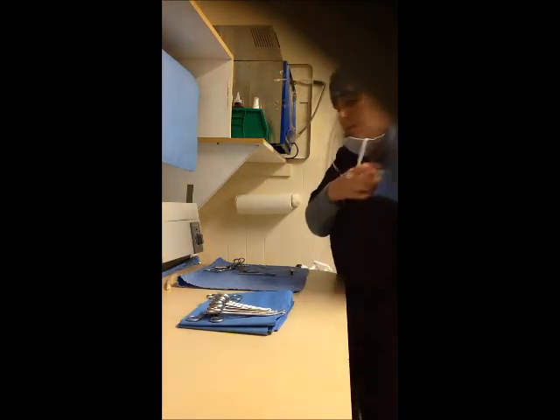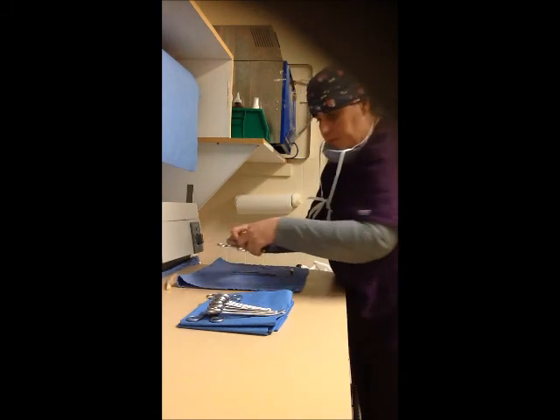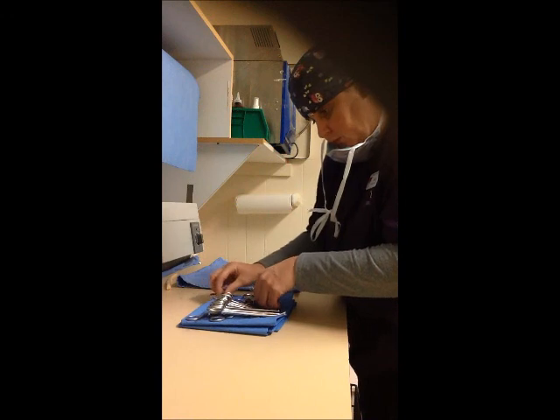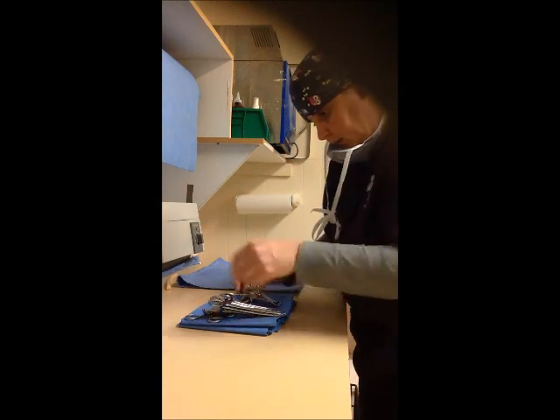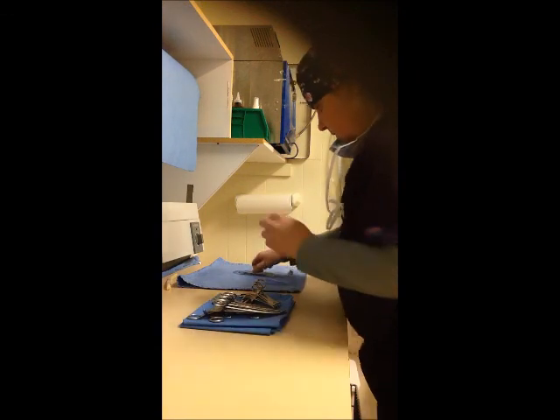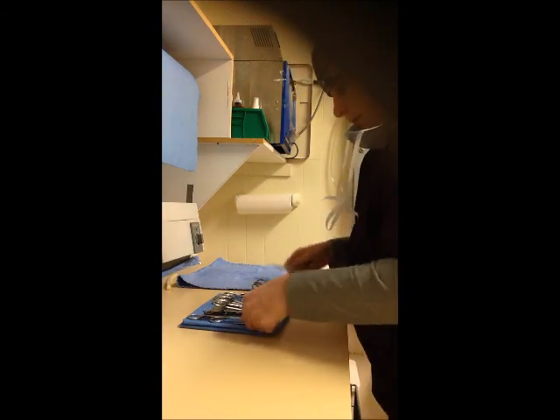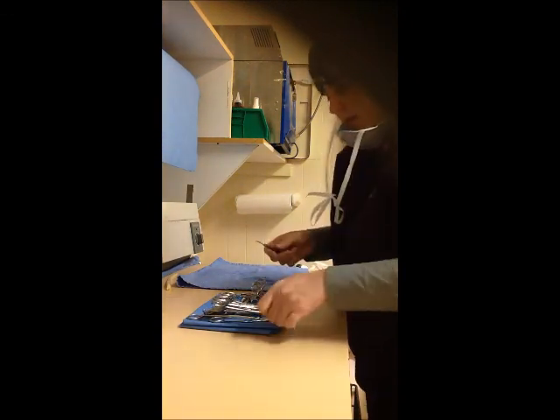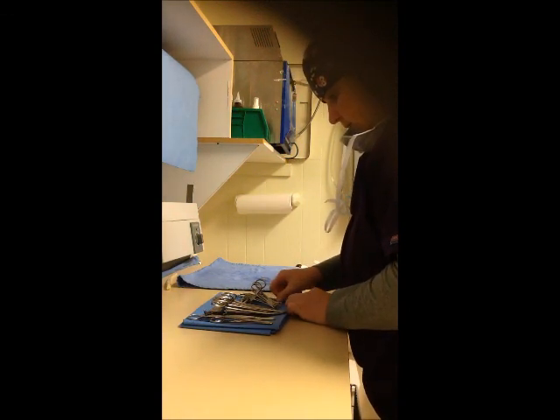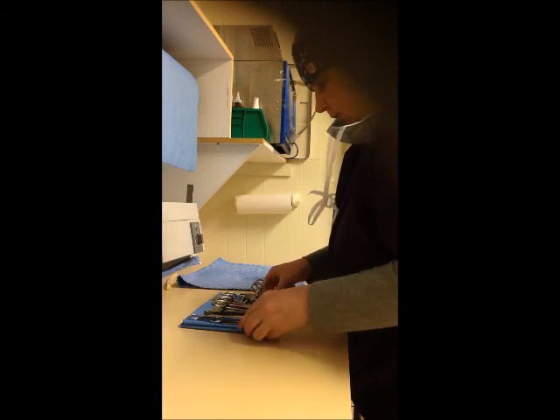Then we put the towel clamps in size order. And we do the same with the needle drivers and the Mayo scissors. And we neatly sit these onto the drape. We put our forceps on one side and our scalpel blade holder on the other.